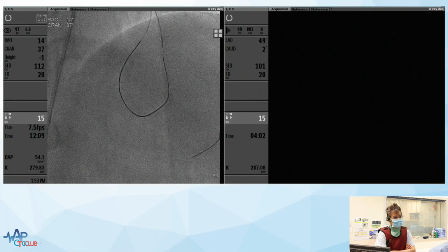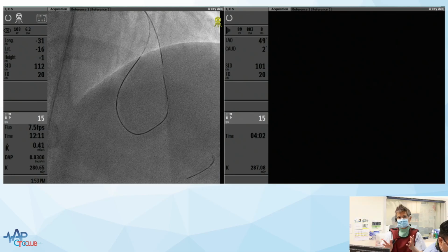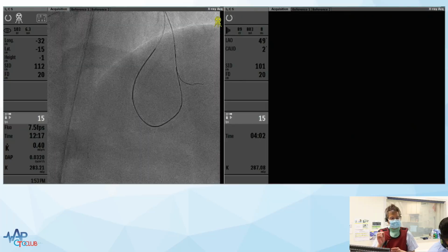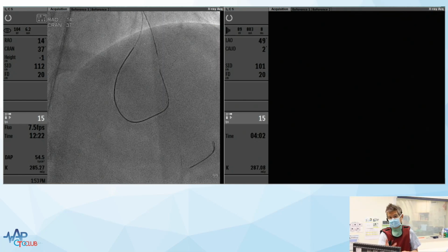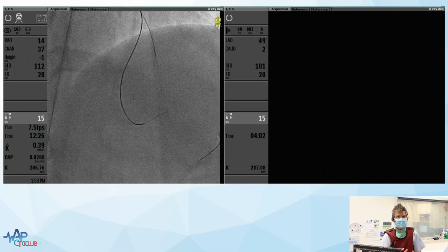Yeah, usually in the anchor ballooning. Totally agree. There are many methods to deal with this, and actually, Manos and I had a long discussion about this. I think there are various ways you can deal with this. One is you can increase the backup with a side branch anchor, or with a guide extension, or a guide extension with side branch anchor, which is very powerful backup.